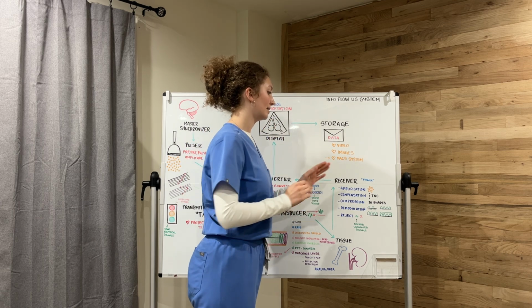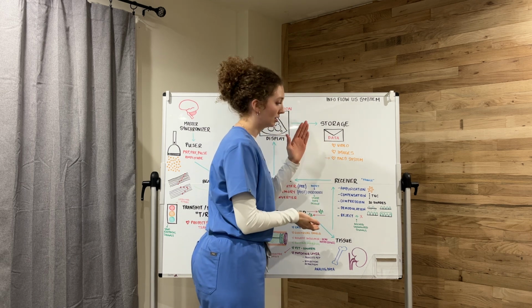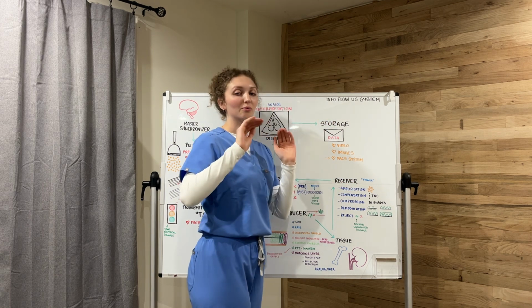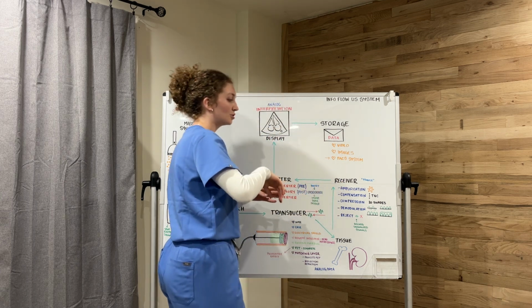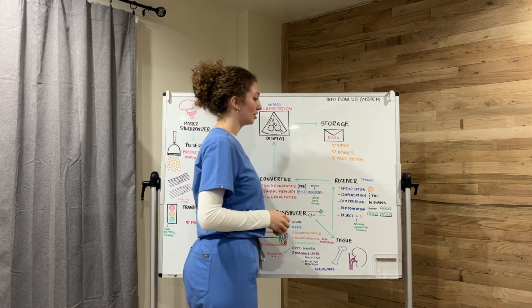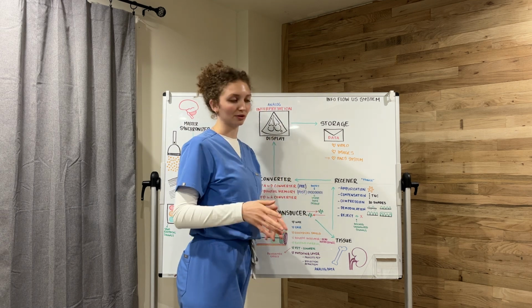One being it transforms those negative waves and translates them into positive waves, and this is a process called rectification. And then another process is it makes a little smooth line over those bumps in a process called smoothing. Lastly, we have the reject, which basically discards the unwanted signals.